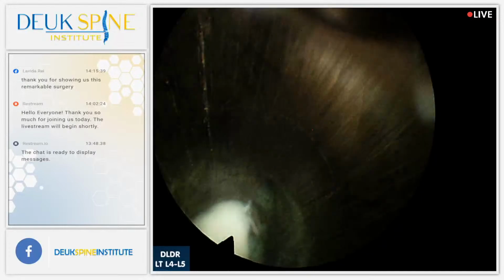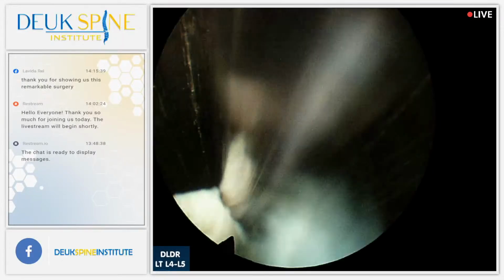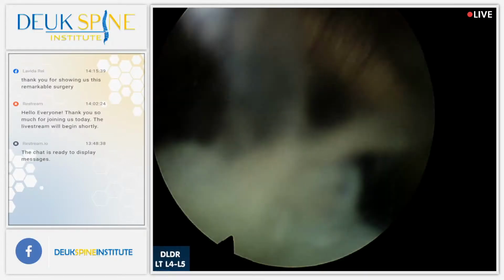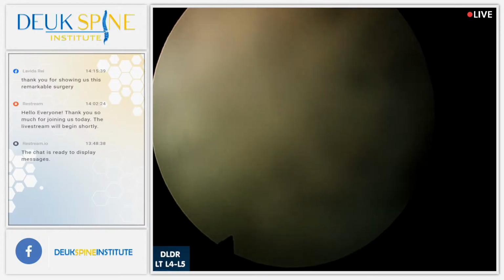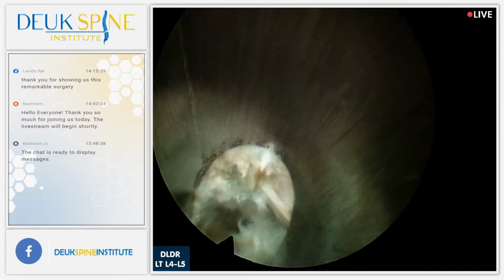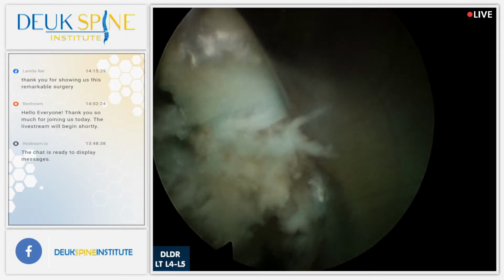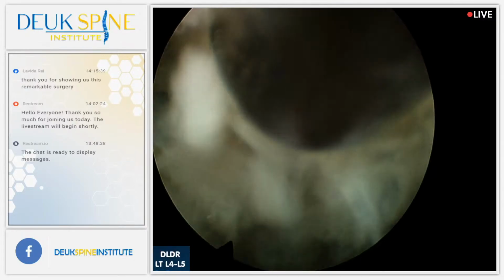The battery is the laser one. Yeah, but you're supposed to plug into the generator power. Is everything right? Yeah, it's supposed to be. So what you're going to do, Jordan, check the breaker there. Yep. This is truly trying times.